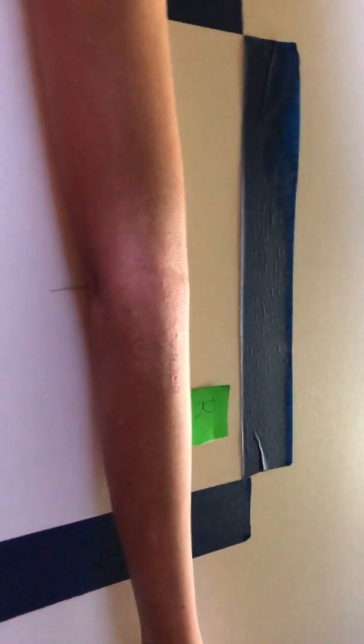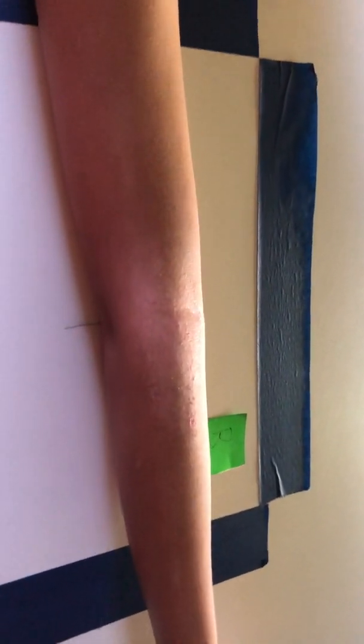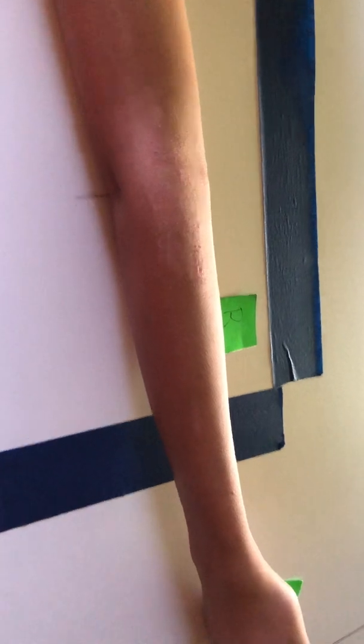So for the lateral oblique, the patient position is extended elbow to the center of the field, which it is. They will externally rotate the hand so that the line of the humeral epicondyles is at 45. The central ray is directed perpendicular to the midpoint of the elbow joint through the center of the field. We're just trying to get the neck of the radius and the tuberosity demonstrated clear without superimposition of the ulna. This is again 10 by 12, 40 SID for both. I never had to move my right marker because we are using her right arm again.